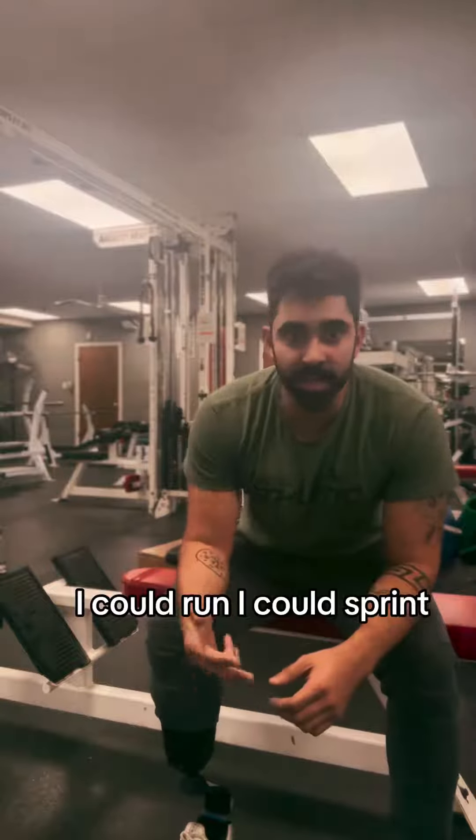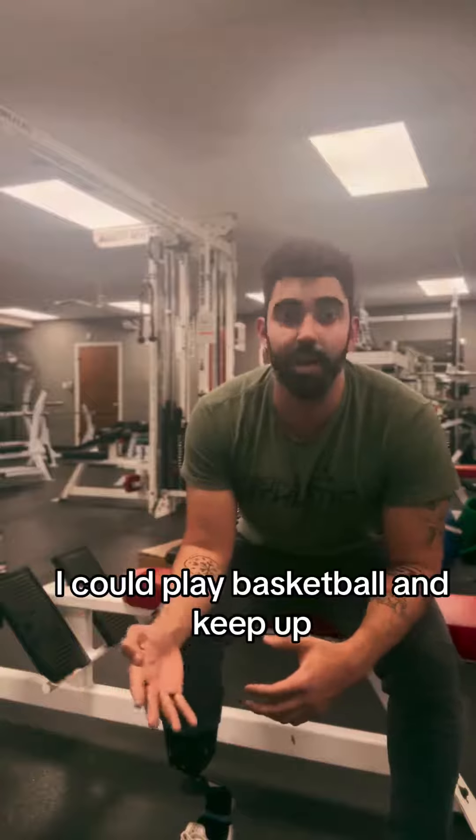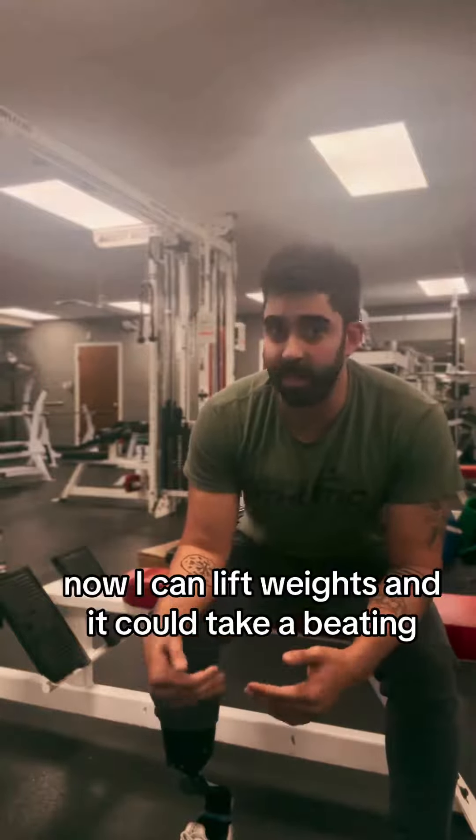I can run, I can sprint, I can move laterally, I can play basketball and keep up now. I can lift weights and it can take a beating.